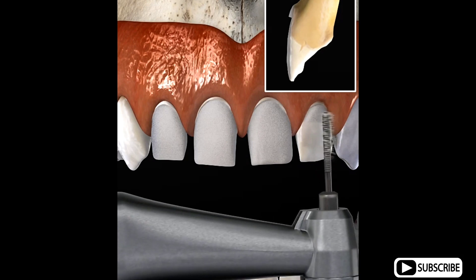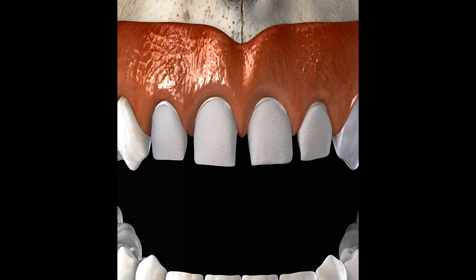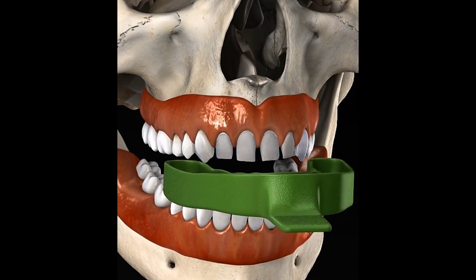When all the affected teeth have been prepared, an impression is taken of the teeth. The impression is used to make a cast of the teeth, which is sent to the laboratory.